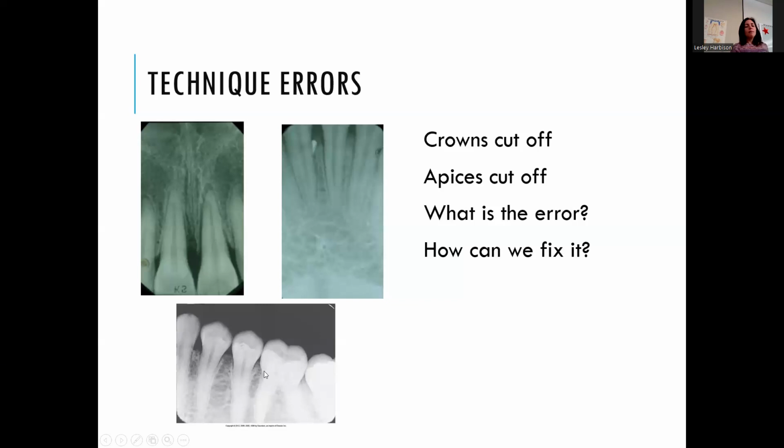Cutting off, a lot of times what you'll do more than cut off the incisal edge is you'll get not enough bone around the apices. But this just has to do with placement. The biggest reason this happens is if you use the stickies instead of your XCPs. We have the stickies because they are a little easier for patients to tolerate, but if you don't put it in the right area, you'll cut off the incisal edge. You have to put it in the right area so when they bite, it covers enough of the tooth.